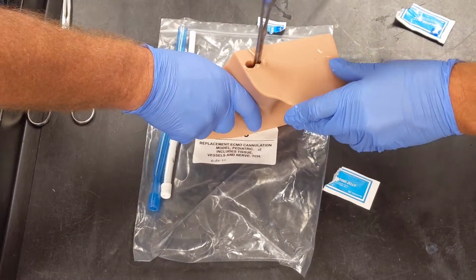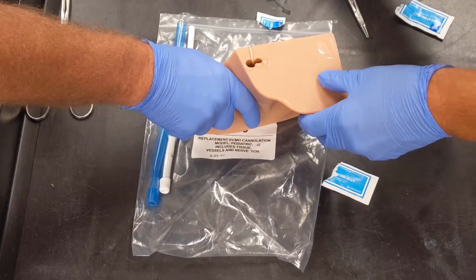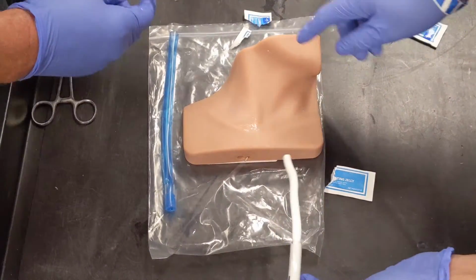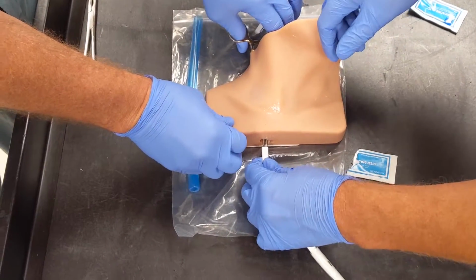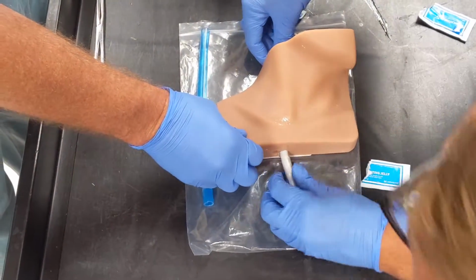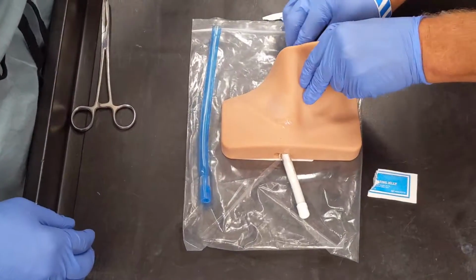Okay, you got that in there. This is the vagal nerve. We'll adjust that in a little bit. So next step, we usually start with the carotid. Have one person slide it through, open, and then you just kind of help it through like that. Get it set. Move the vagal nerve in the middle so it's midline.